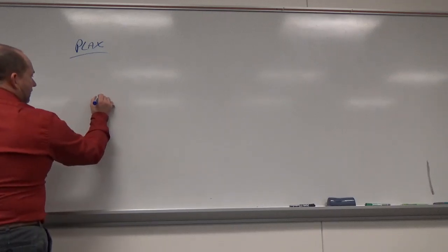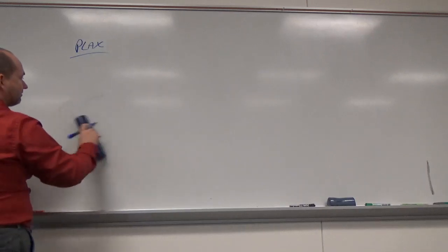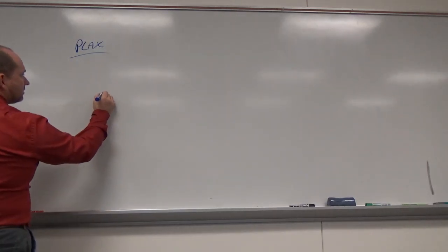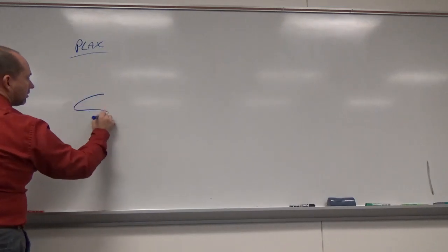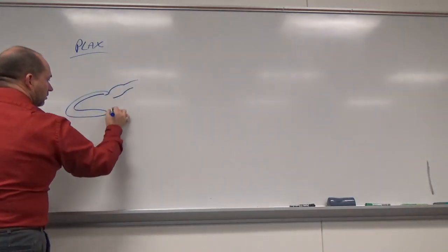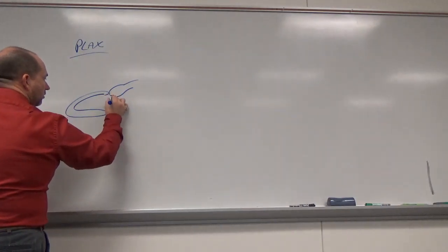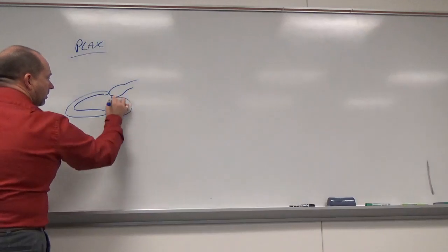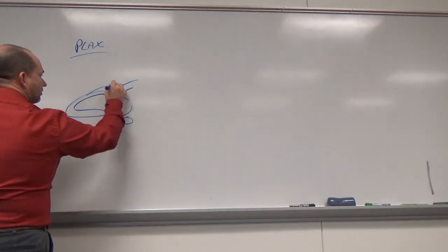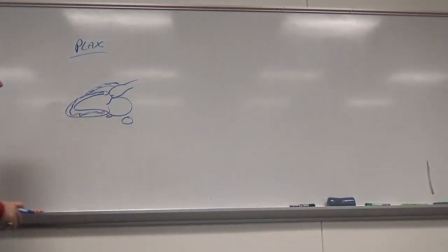So parasternal long axis, that's a horrible heart, hold on. That's a very bad heart. Okay. Don't care about the descending thoracic aorta, but we'll draw it on there anyway. Okay, so there's our LV.